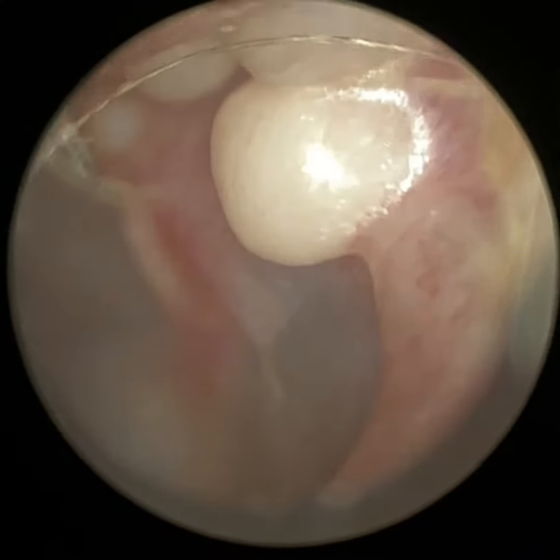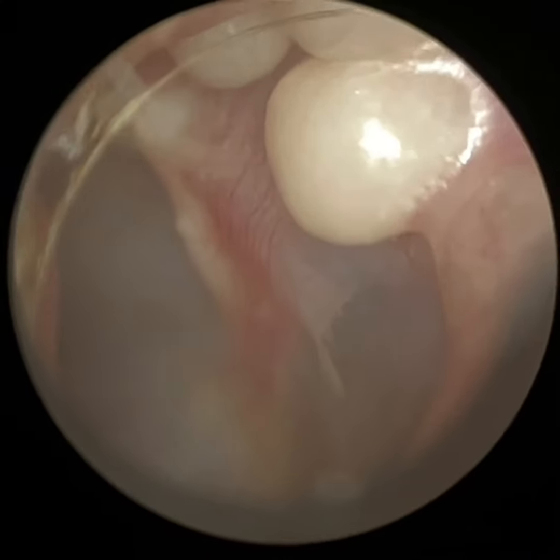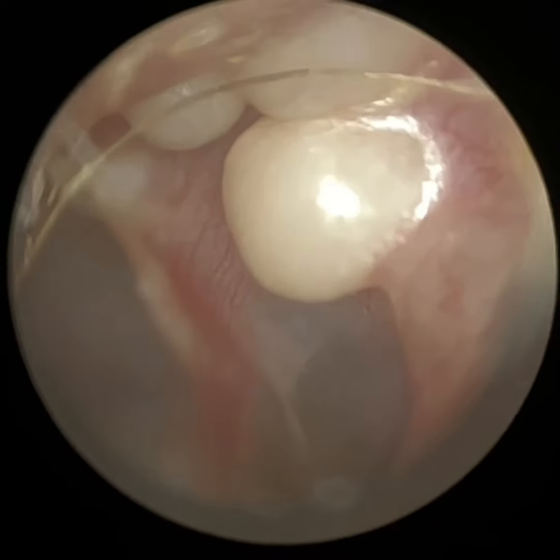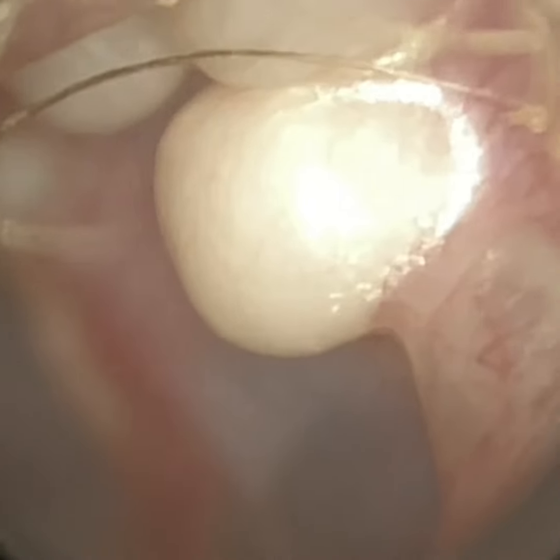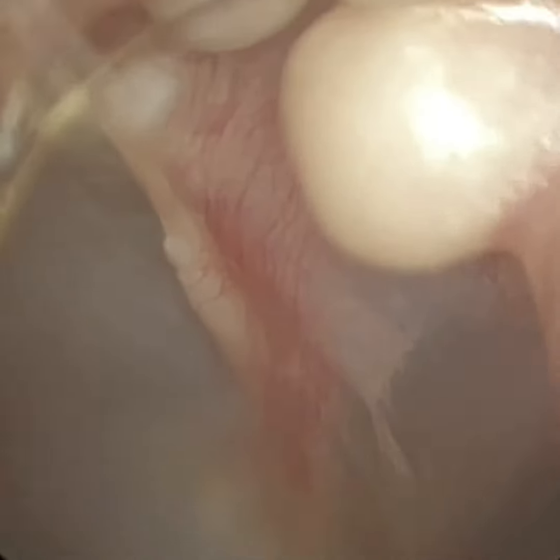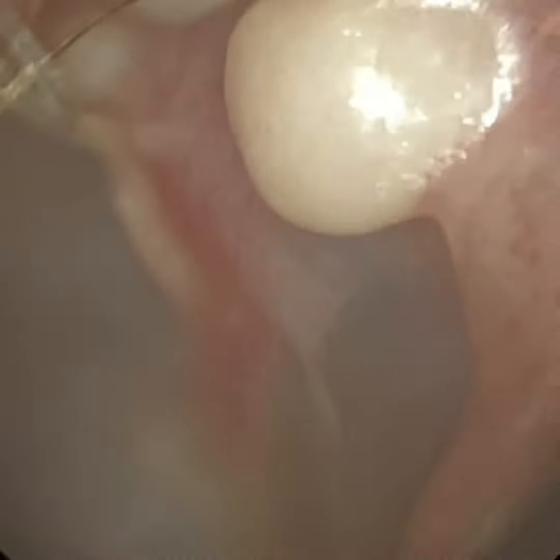You can see that bone is very reflective, and I'm going to zoom in. You've got three packed up on the roof of the ear canal, superiorly. You may have missed them, but there were also one on the bottom right and bottom left. You can just see that one on the bottom right. I'm just getting the eardrum in focus there, just zoomed in.